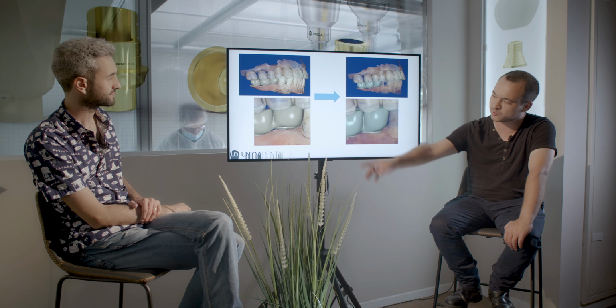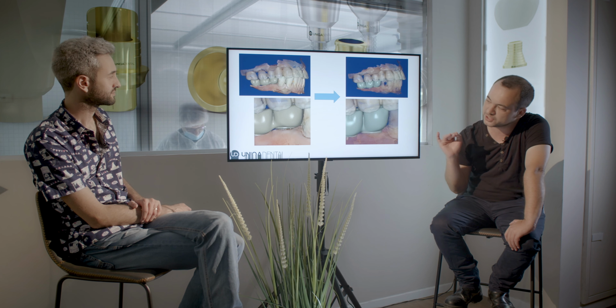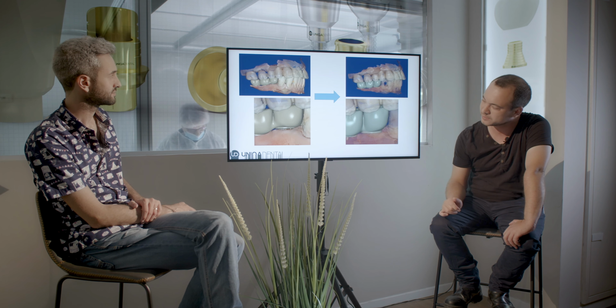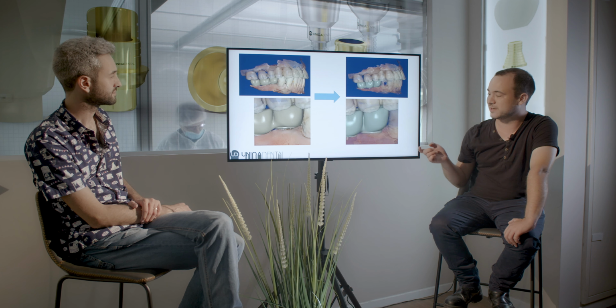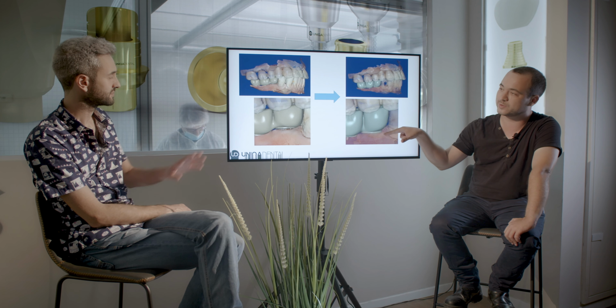Okay, and how does it correlate with our case? Yeah, in the case you can see that originally the crown that the technician designed was above the gingiva by about half a millimeter. After changing the multi-units, the crown was half a millimeter below the gingiva.